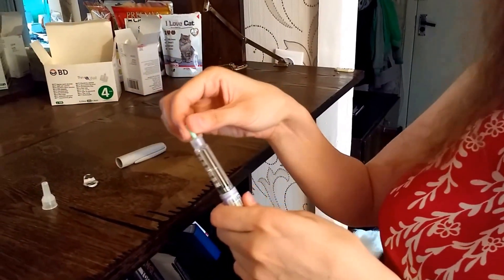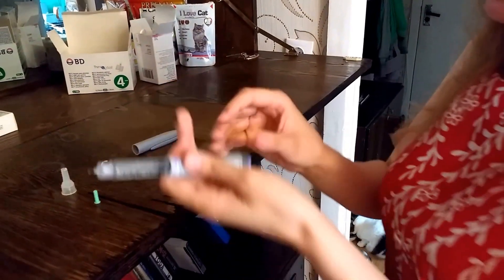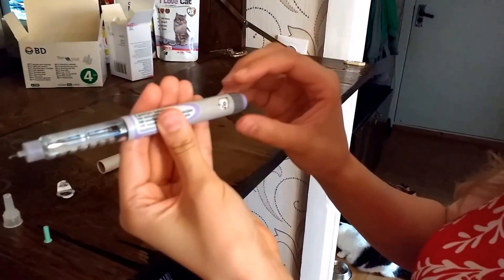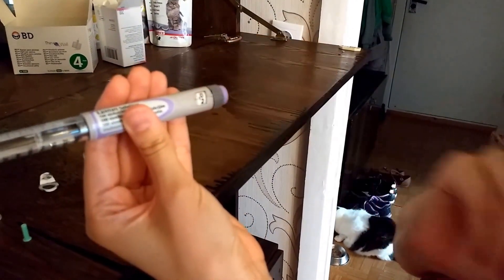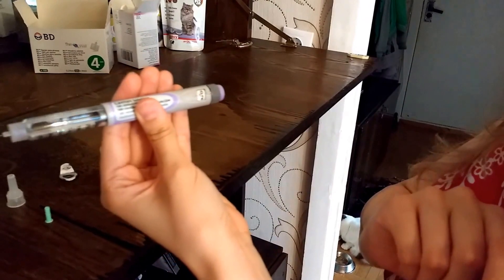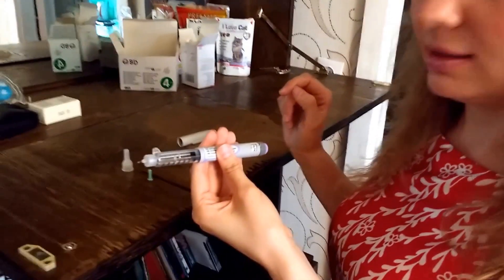Then take the green bit off. Here are the units — it's very easy. You put it on however many units you need. At the moment I put it on one unit, and then you are going to start injecting the cat.